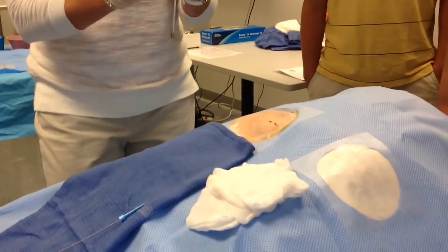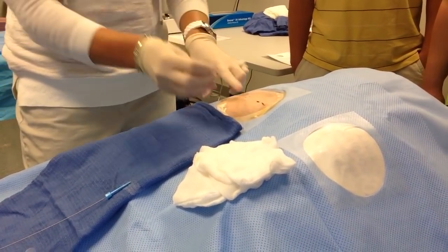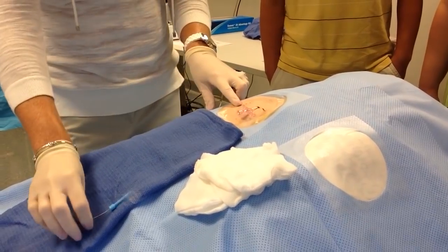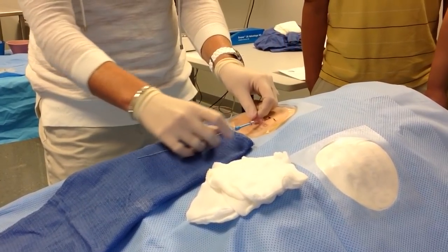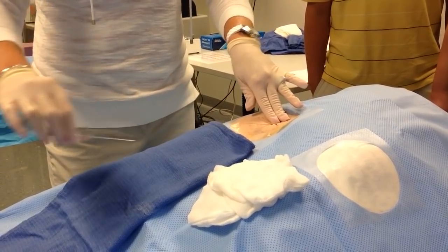And they take their needle, beveled side up like that, and they would go in at a 45-degree angle. Once you see pulsatile blood flow, they advance the short guide wire. They'll hold pressure here, take the needle out.